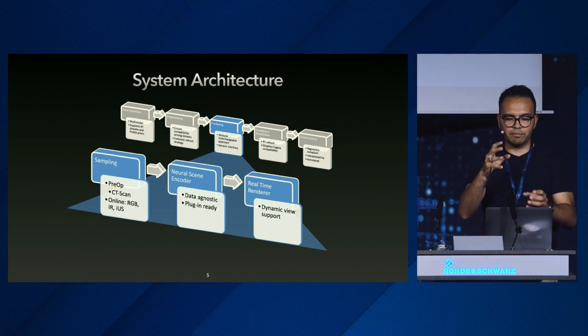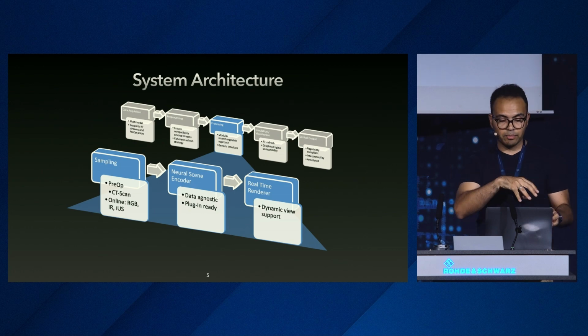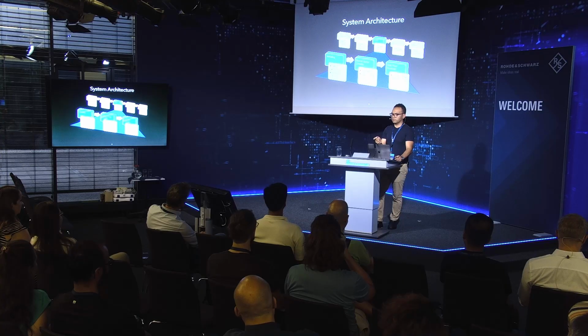So what you can basically do is take out this box and put it in again, or put in another one that has the same interfaces, which are generically defined, and you're good to go. You can reconstruct your model, as we just saw some slides before. And in the end, we have this real-time renderer, which renders the whole thing in real time, as the name says, but also allows generatively picked visualizations that the doctors can use offline or online.